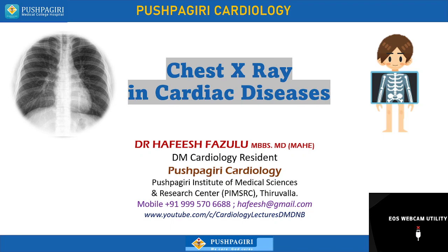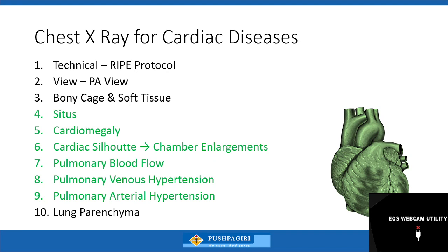Sir, today we'll discuss chest X-ray in diagnosing various cardiac diseases, from basics to advanced. Today we'll start with the basics of interpretation of chest X-ray also. So chest X-ray should be interpreted as a 10-step protocol. Initially we have to look at the technical part, that is, we use the RIPE protocol. It will come to it.